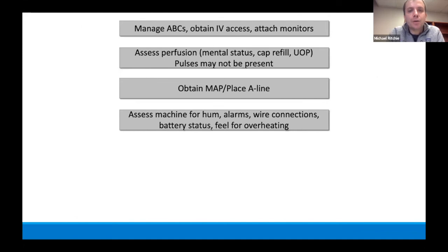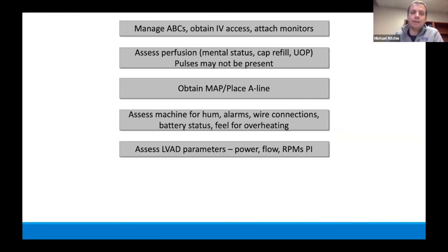And then after that, you want to really assess the machine. You want to hear that hum. You want to see if there's any alarms, make sure everything's connected, make sure your batteries aren't dead, and then feel if it's overheating or having any issues.